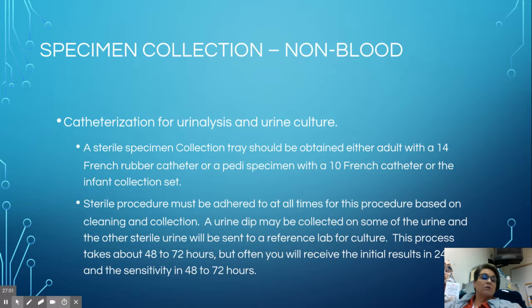So that sterile field is maintained so that you're not putting something, because when you put your finger in to get a urine dipstick out, you're introducing bacteria to the end of those urine dipsticks. And if you put that into that urine specimen, then you have contaminated that urine specimen. So you got to be sure that when you do collect a sterile urine for a UA and a culture, you get the culture set up first.